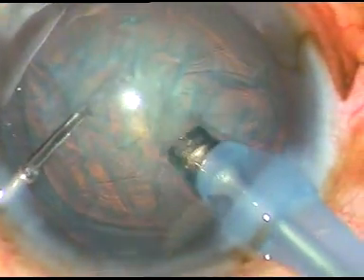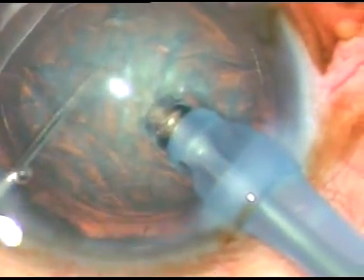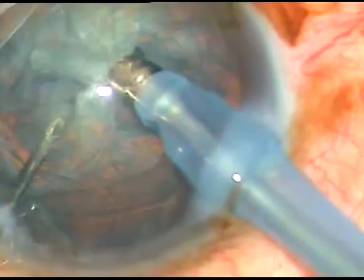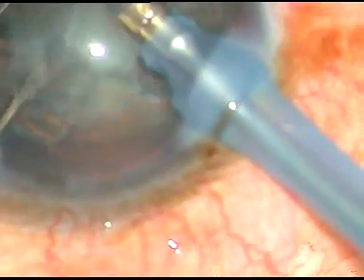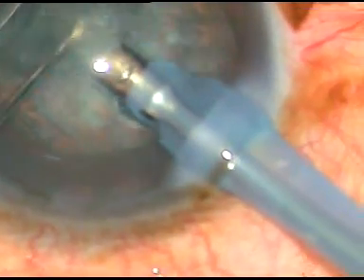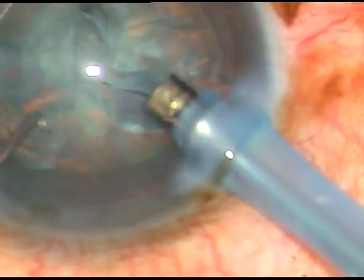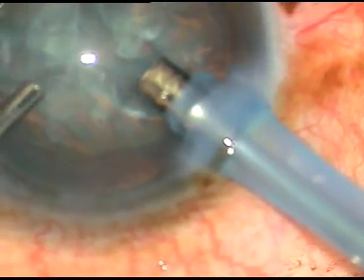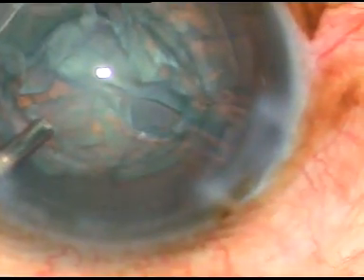Now I'm going to do direct chop. I impale the nucleus, go deep, and then I chop the nucleus into 2 halves. Then I try to emulsify this half, and I notice, which is not visible in this view, that the capsular bag tends to detach from 5 o'clock. So I inject viscoelastic substance and come out.